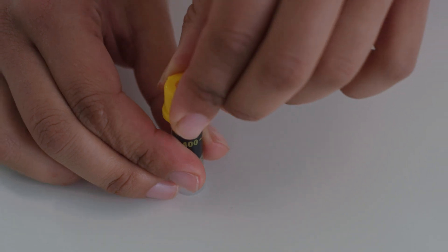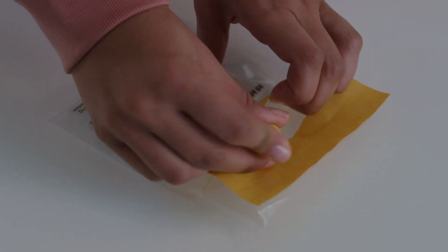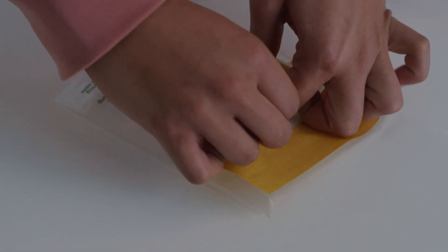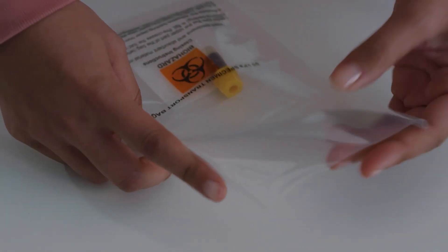Push the yellow cap firmly back onto the tube. Gently turn the tube upside down five times. Place the sample tube inside the specimen transport bag, peel off the yellow strip, then fold and seal the bag.